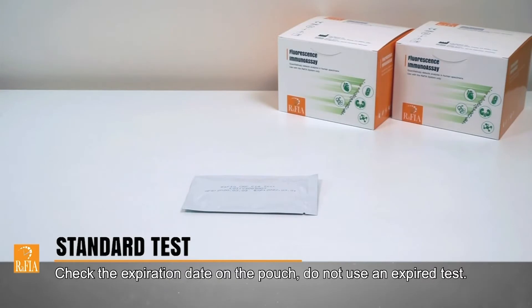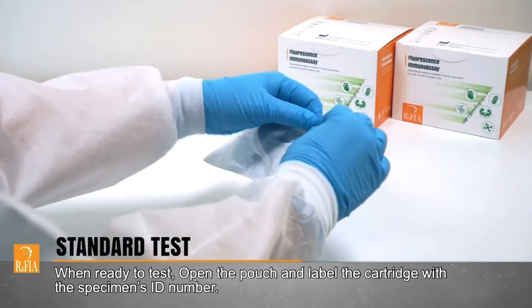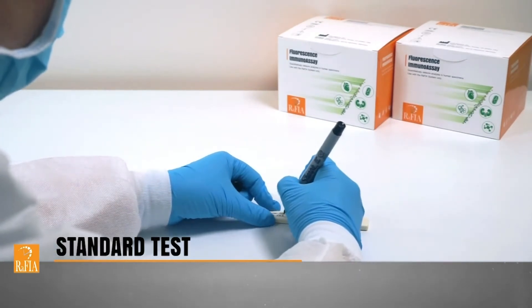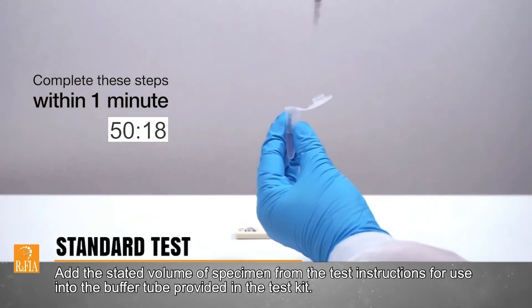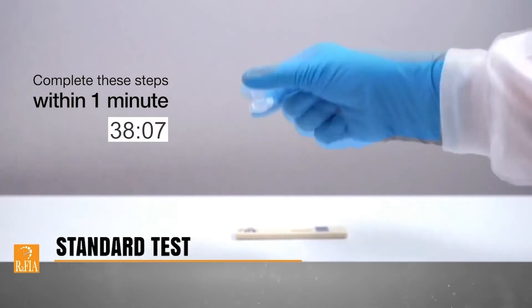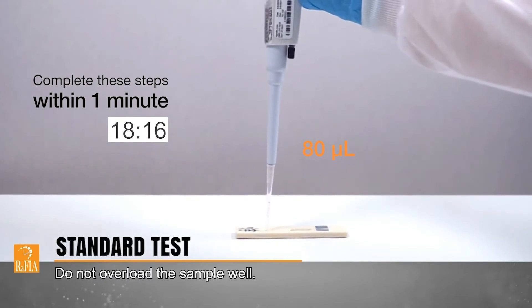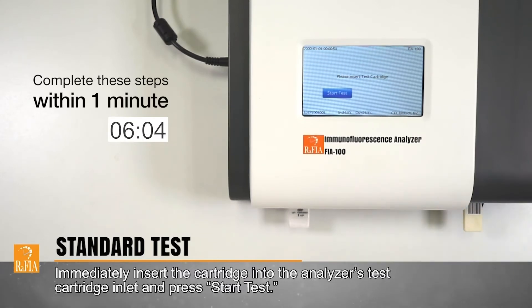Check the expiration date on the pouch. Do not use an expired test. When ready to test, open the pouch and label the cartridge with the specimen's ID number. Add the stated volume of specimen from the test instructions for use into the buffer tube provided in the test kit. Mix the specimen and detection buffer well by tapping or inverting the tube. Load 80 microliters of the specimen mixture into the sample well of the cartridge, ensuring there are no air bubbles. Do not overload the sample well. Immediately insert the cartridge into the analyzer's test cartridge inlet and press Start Test.